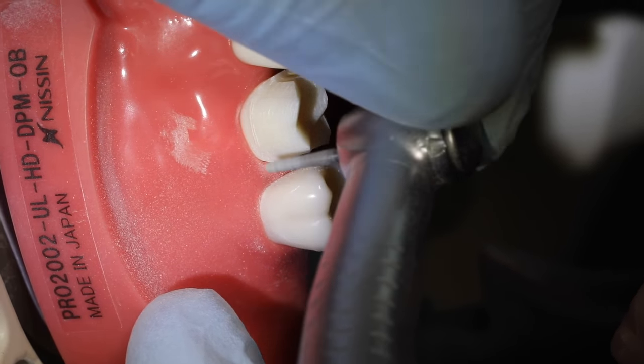And now let's connect at the line angles. Now the hardest one, the distal lingual, but it's easier up here than it is on a mandibular molar. Gonna have to lengthen that burr a little bit.